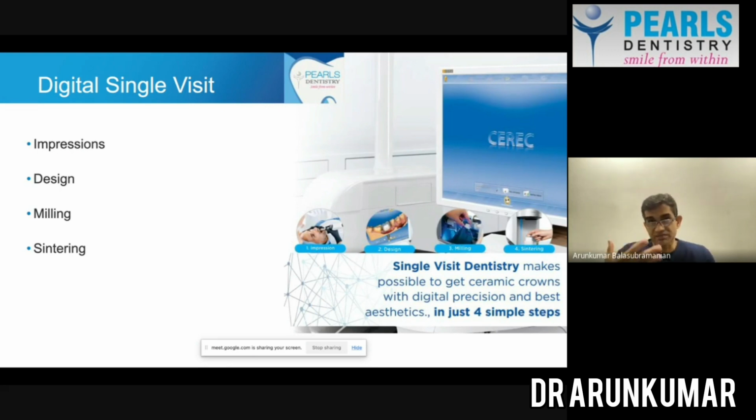So once this digital impression is made, the second part is designing the restoration. The tooth that we are going to make is actually designed using an intuitive computer software, where we can actually design a tooth structure. And then the third aspect is the milling aspect, where we will use a milling unit to actually fabricate the tooth structure. The final aspect is called the sintering. And sintering is a process in which the fabricated tooth structure undergoes a strengthening process, where once the strengthening process happens, the tooth is ready to fix onto the patient's mouth. So this is what single visit dentistry is in short. Those 4 important steps of impressions, design, milling, and sintering.